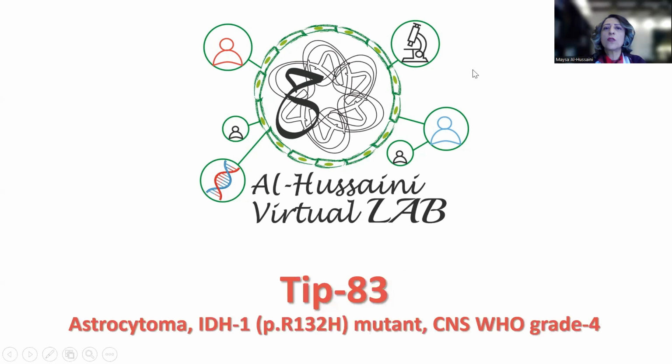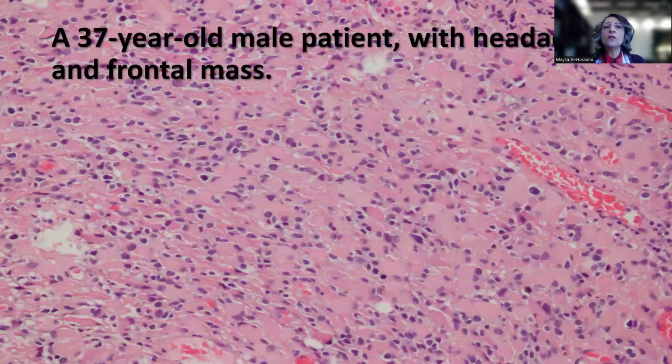What I'm going to be sharing with you today is a nice case of a grade 4 IDH mutant astrocytoma. So this is a case of a 37-year-old male patient who presented with headache and was found to have a frontal mass. And as you can see here from the low power magnification, the tumor is pink in color. This is because of the predominance of gemistocytes as the proliferating cells. So these are large cells with abundant acidophilic cytoplasm and eccentric nucleus.